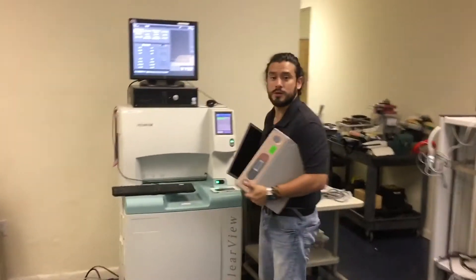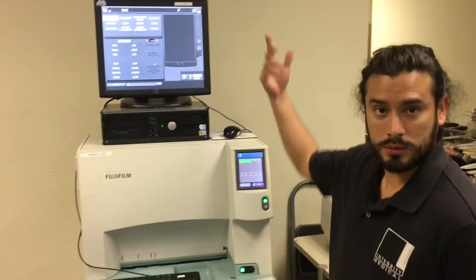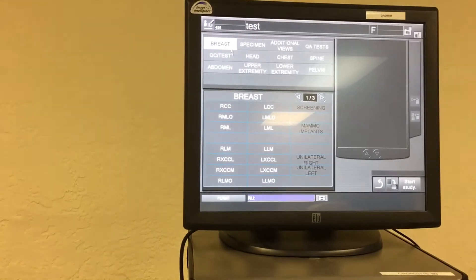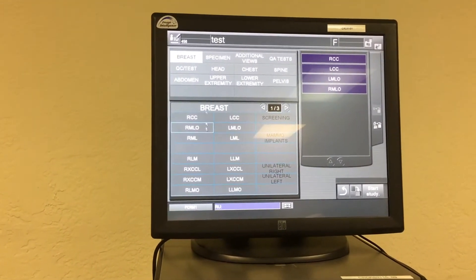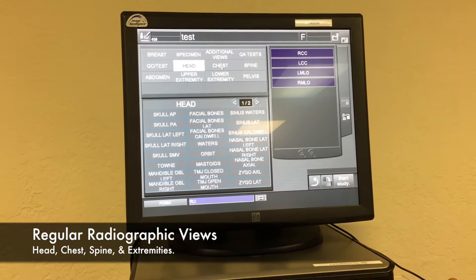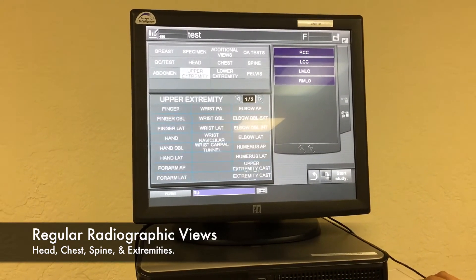Closer to the screen, we already have enabled all these options. In breast, you will have your regular sub-options. We also have the regular radiographic views: head, chest, spine, and extremities.